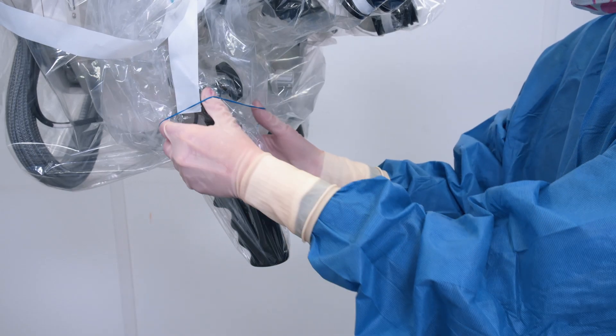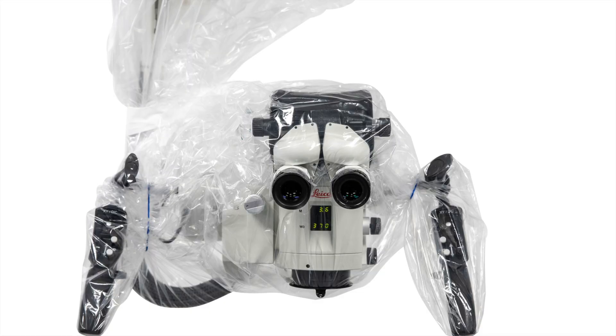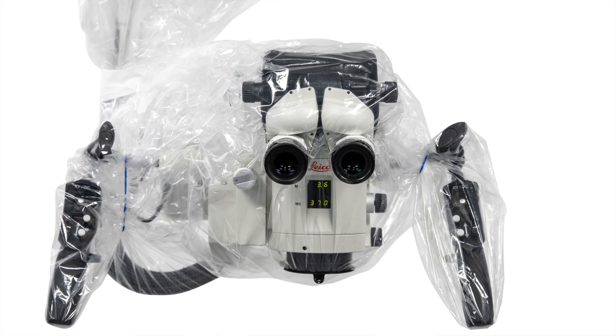If necessary, the rubber bands can be used to keep the drape tighter to the handles and the main surgeon and assistant binocular tubes.